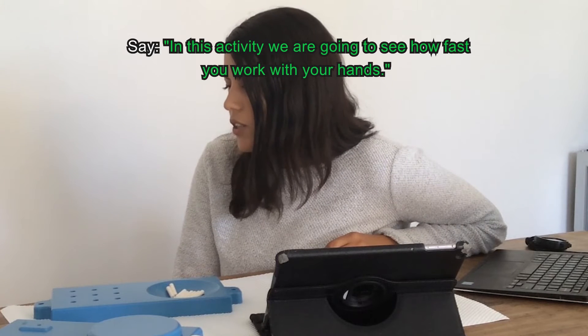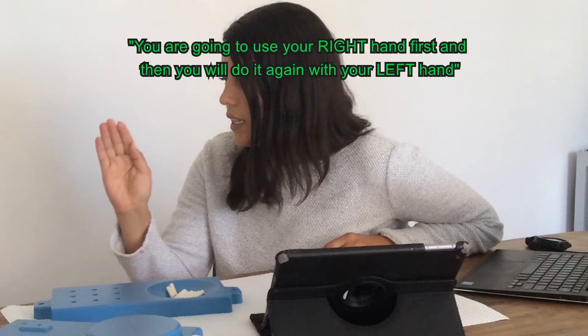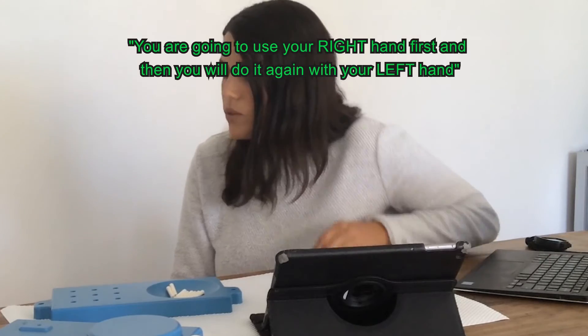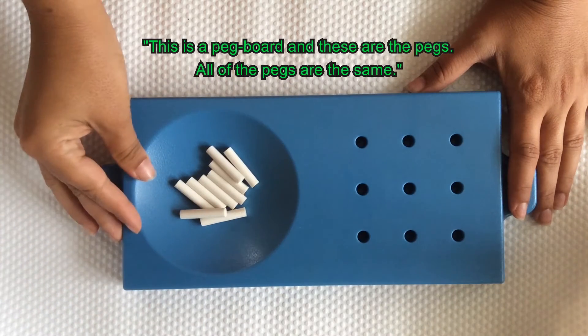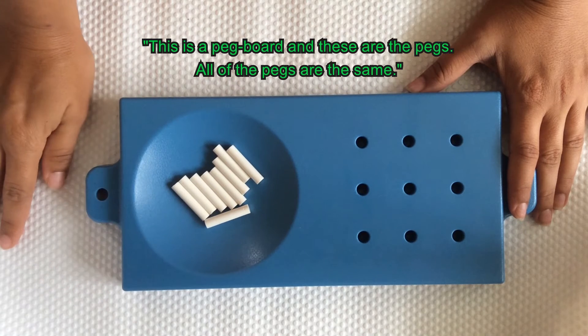In this activity, you're going to see how fast you can work with your hands. You're going to use your right hand first, and then you'll do it again with your left hand. This is the peg board and these are the pegs. All the pegs are the same.